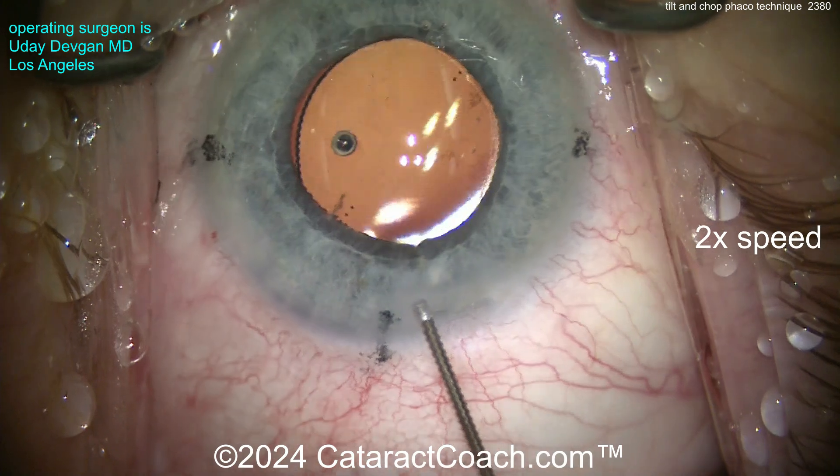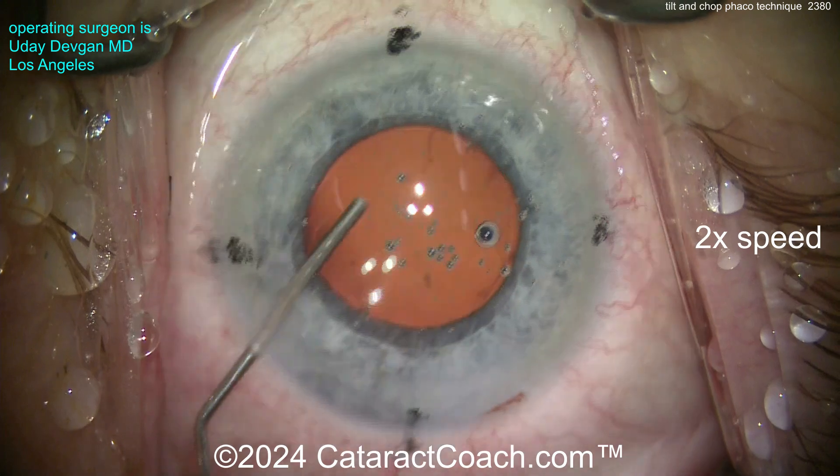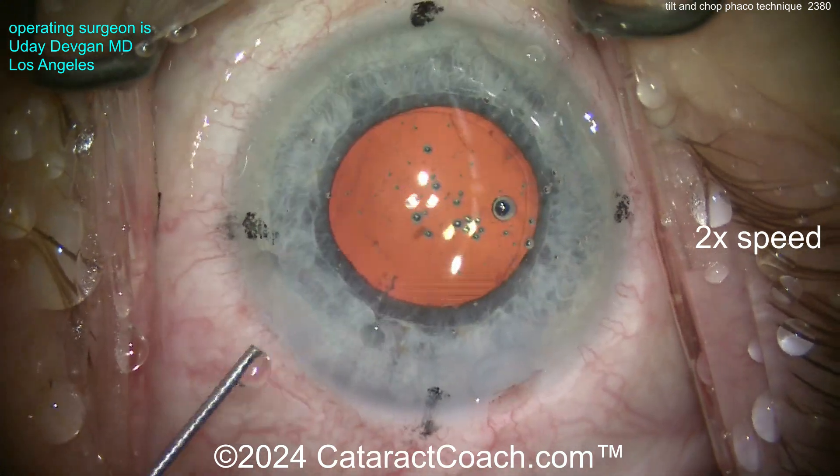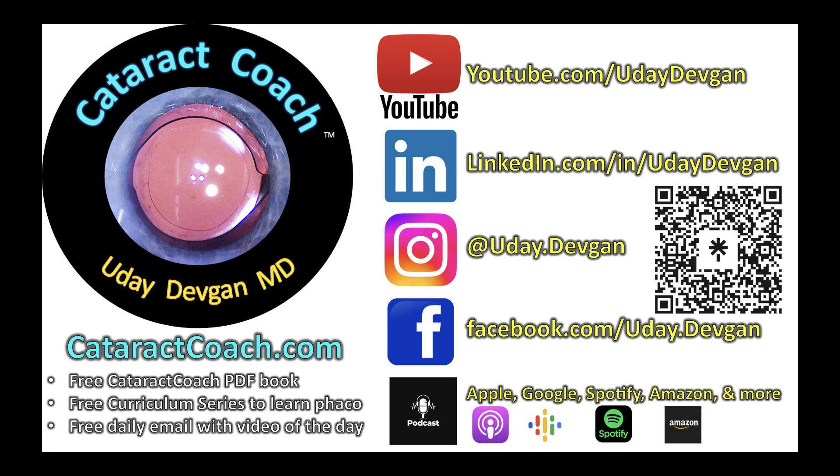End of the case: hydrate the incision, center up the lens, do some final positioning. Now you know how to do tilt and chop — you've got to try it, I promise you're going to love it. Check out the podcast everywhere you find your podcast services.